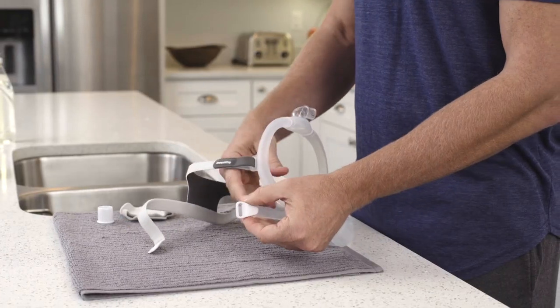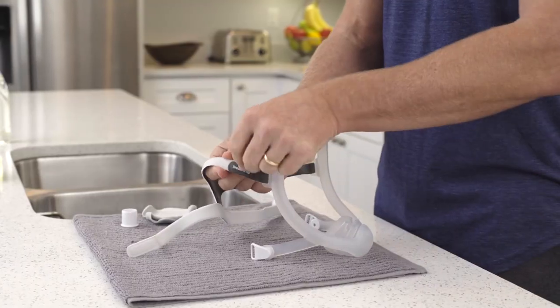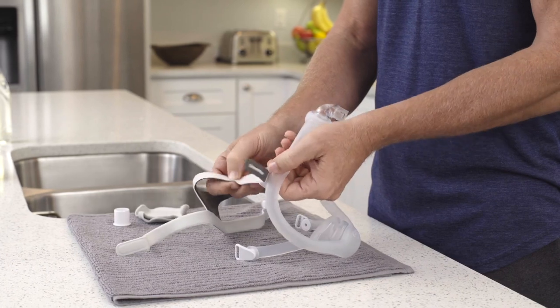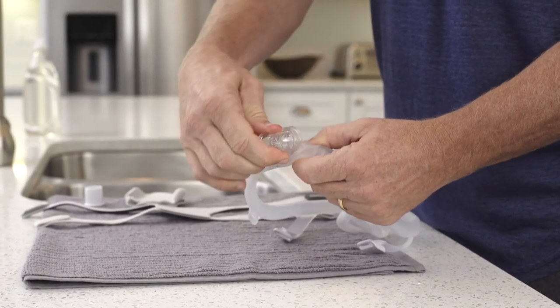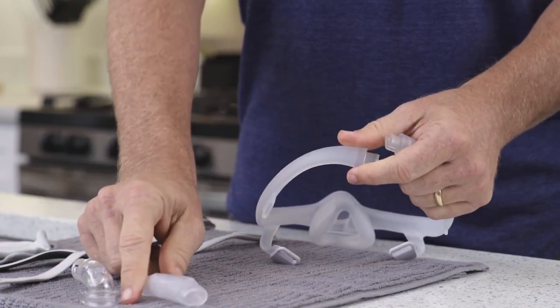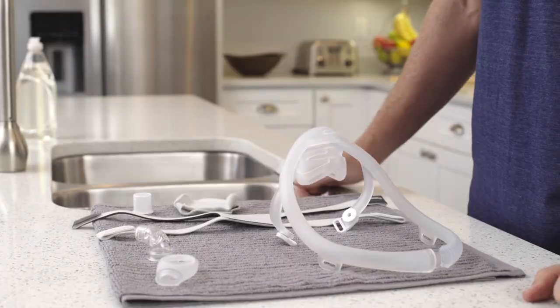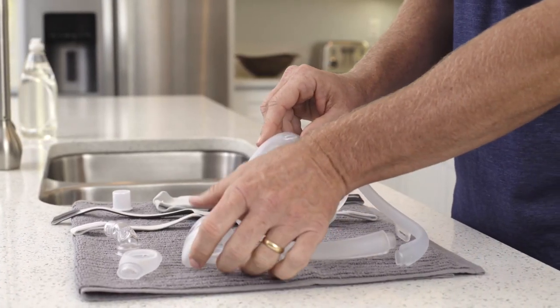Unless you're replacing them, leave the magnetic clips attached to the frame. Undo the tabs on the top strap and disconnect the strap from the frame. Now remove the elbow from the top of the frame size connector. Disconnect the frame size connector from the mask frame. Finally, pull the cushion from the mask frame.